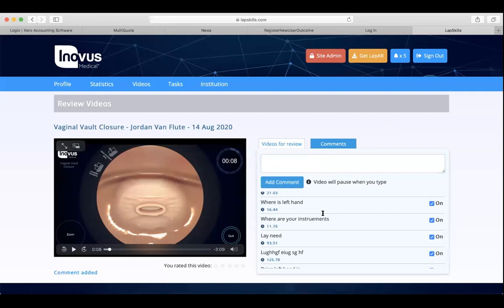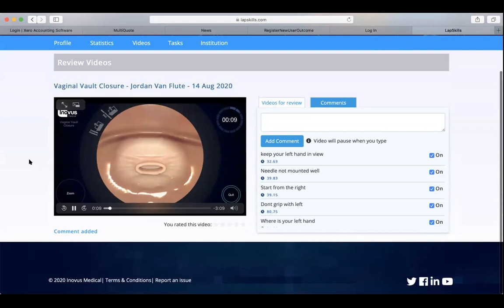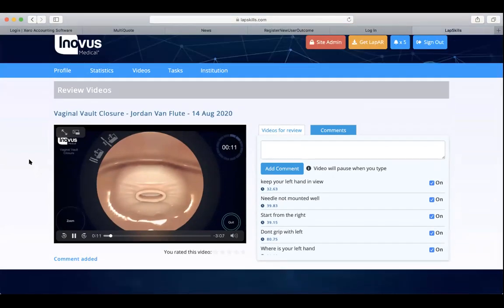And I can add that comment into the feed. And then I can carry on reviewing the video and I can let that run a bit longer and we'll let some instruments come into play.